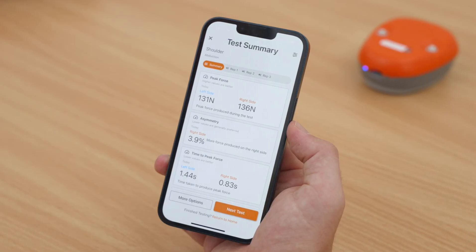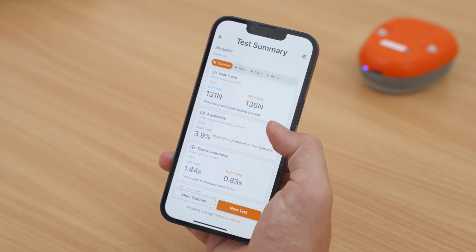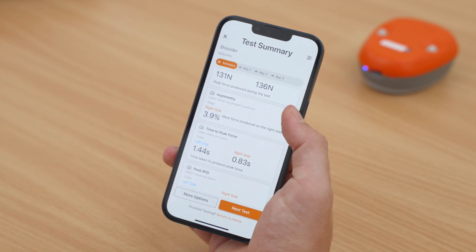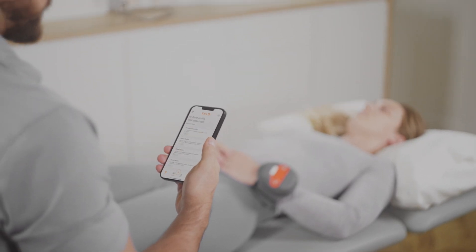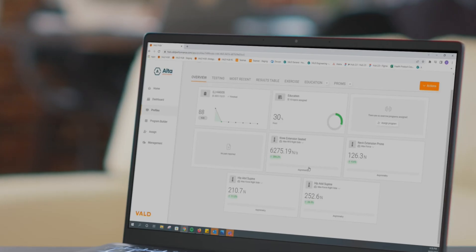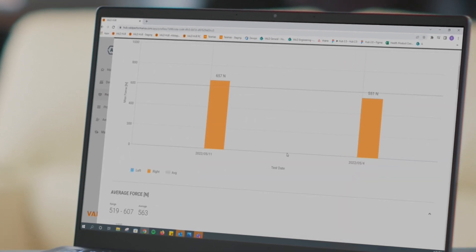You will then see a test summary screen where you can assess both peak and mean force, rate of force development, time to peak force, and asymmetry. You can immediately discuss the results with your client. Your client profile and test data will also automatically upload to Vault Hub, where you can access and analyze the data on your computer.